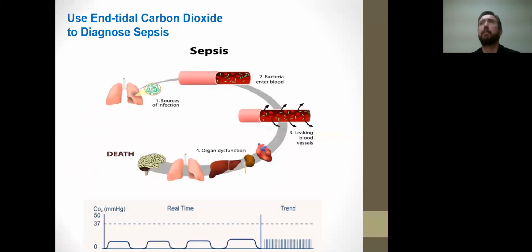Now let's talk about metabolic derangements here. Okay, we can even use this end-tidal CO2 to help assess sepsis. So end-tidal CO2 levels correlate with elevated lactate levels. Yes, it's true, which can predict mortality in patients with suspected sepsis. So if oxygen isn't readily available to body cells, anaerobic metabolism is going to occur with lactic acid as a byproduct. So that serum lactate is what's going to measure that. It's going to indicate low tissue perfusion, or in other words, hypoxia.